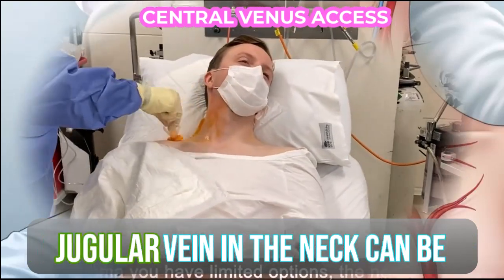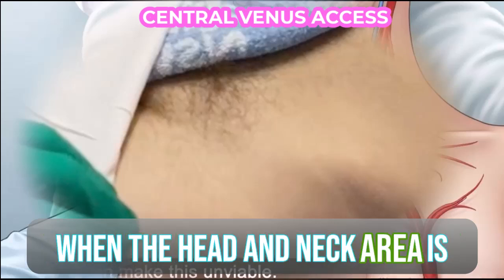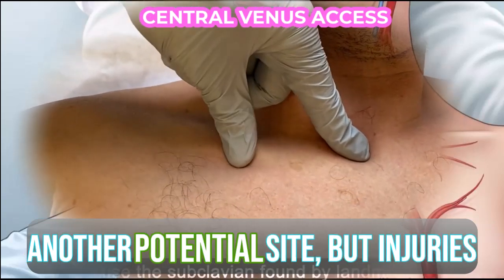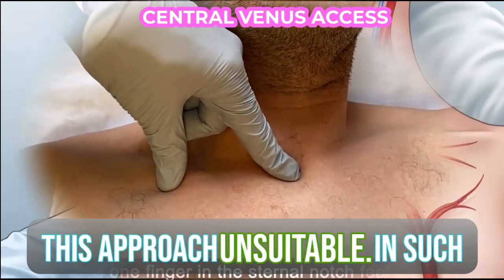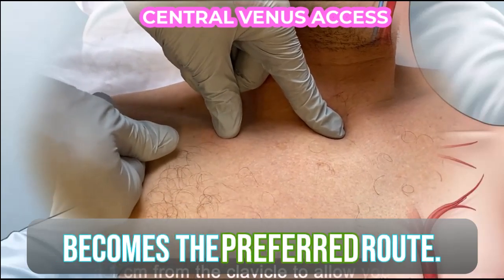The internal jugular vein in the neck can be difficult to approach, especially when the head and neck area is already occupied during resuscitation. The femoral vein is another potential site, but injuries to the pelvis or abdomen may make this approach unsuitable. In such situations, the subclavian vein becomes the preferred route.